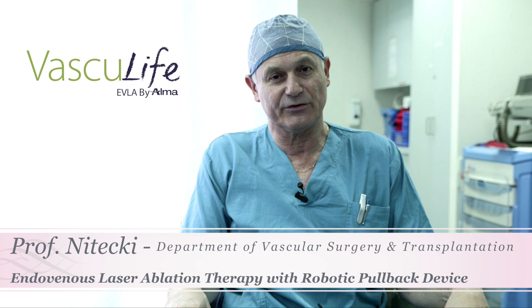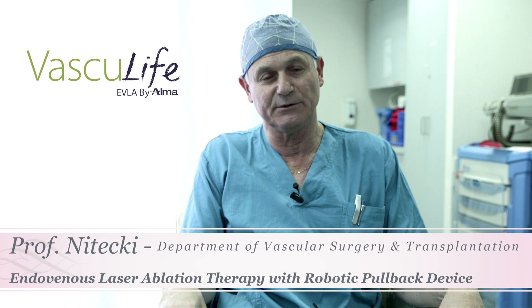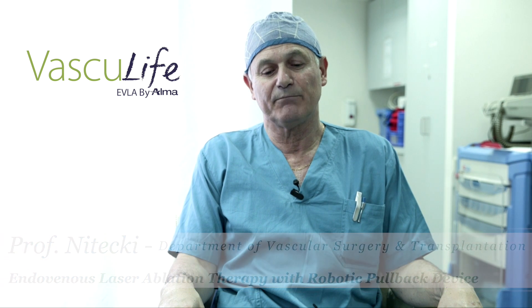You can measure along the laser every centimeter because there are marks that are very, very easy visible. It can be manipulated even through tortuosity.